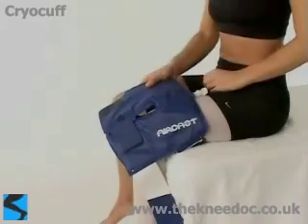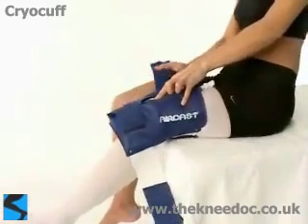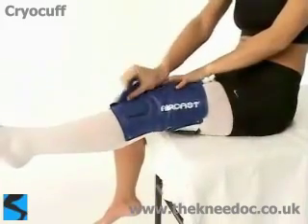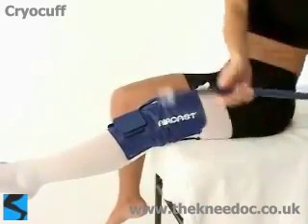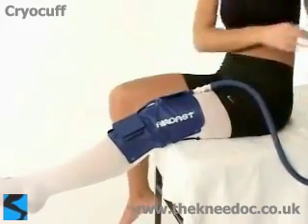This video will run through how to use and put on your Cryocuff. The Cryocuff is an excellent device to reduce swelling in the knee, both after an injury as well as after surgery. The reduction of swelling is the key to progressing through a rehabilitation program, and so it is important to use any means to reduce the swelling safely.